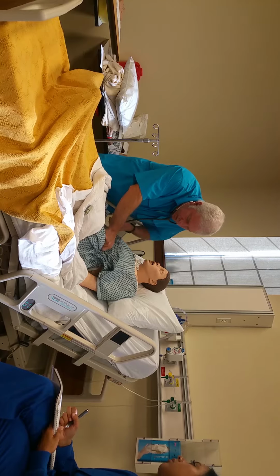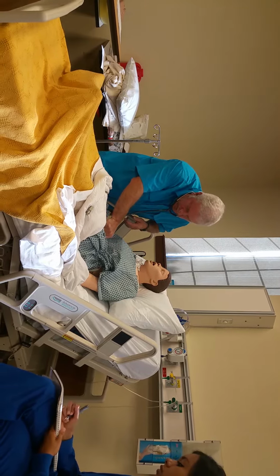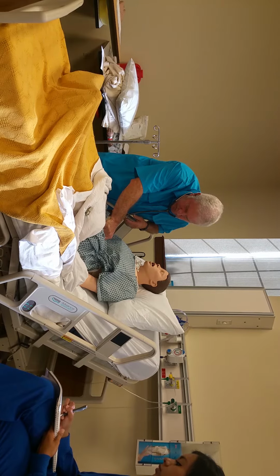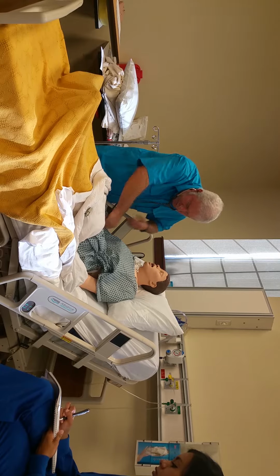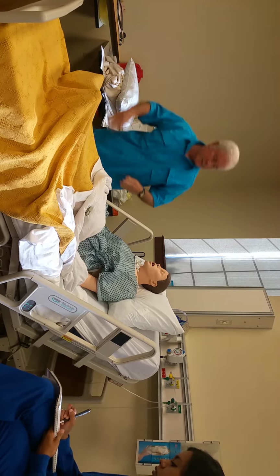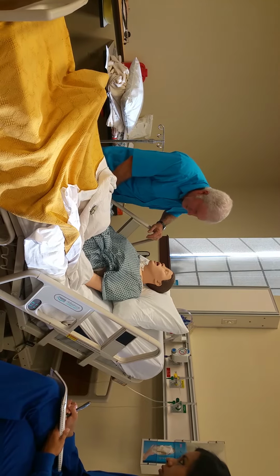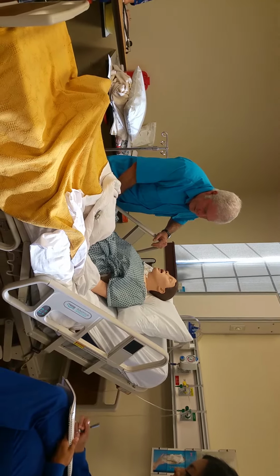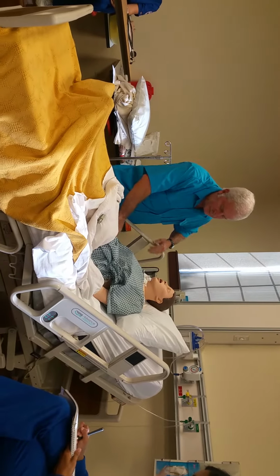So there I heard a gurgle, there I heard a gurgle. Go into the left lower quadrant, hear a gurgle. Right lower quadrant, hear a gurgle. Now I'm done with my stethoscope. I can take it off and put it around my neck, and then I'm going to palpate, okay? So I'm going to lay you a little flat so I can examine your abdomen a little better. And you can palpate them through their gown, okay?